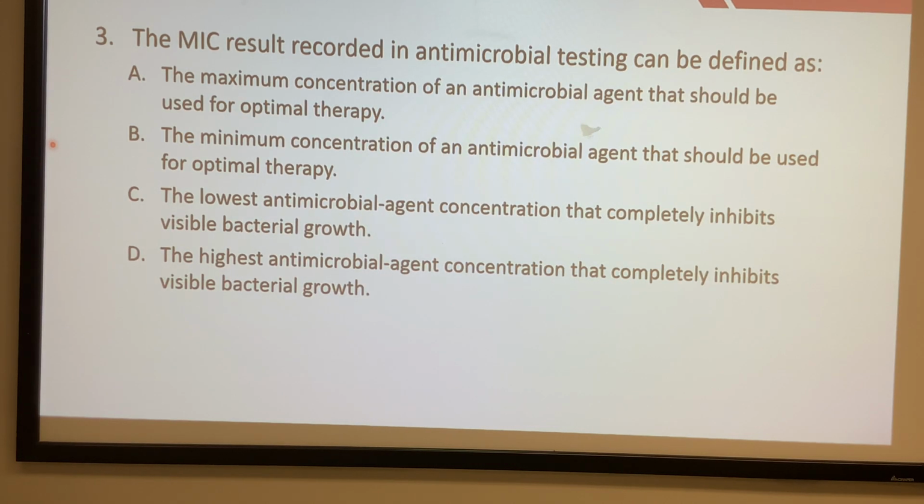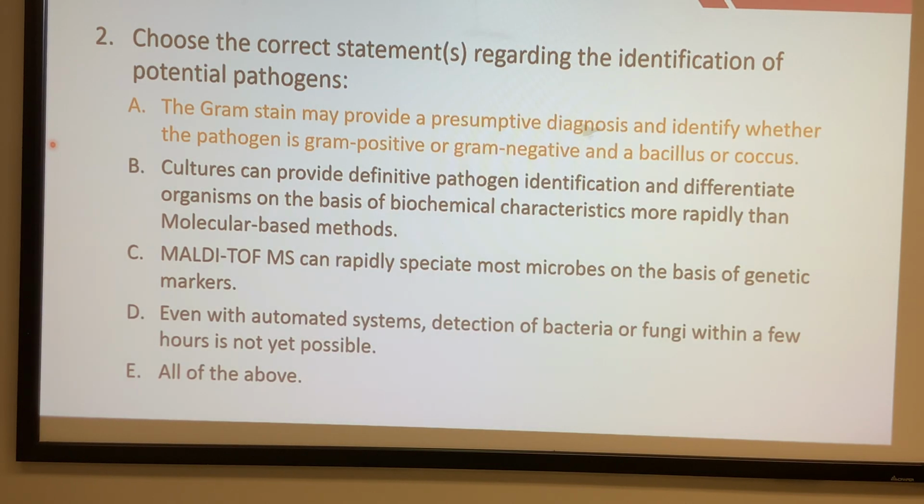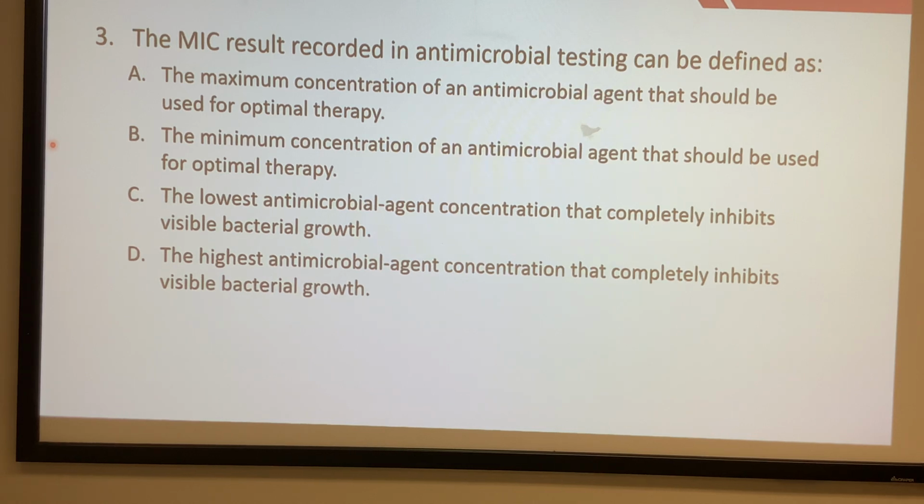Okay. Sorry, you said it was wrong. C is wrong because it's targeting the organism itself, not the genetic markers. It is using the organism to make a fingerprint, a different presentation in the mass spectrum. The genetic markers are analyzed by molecular methods. Okay.